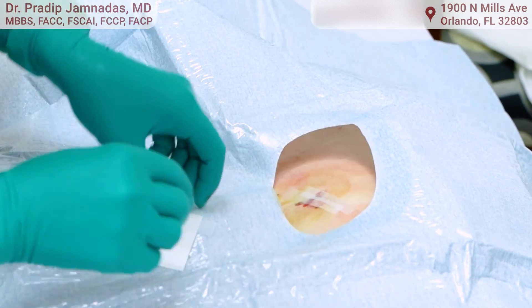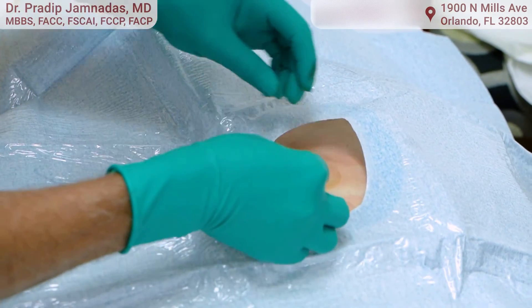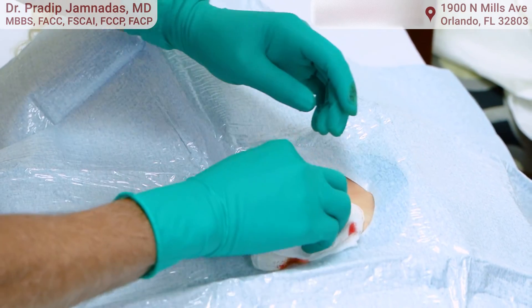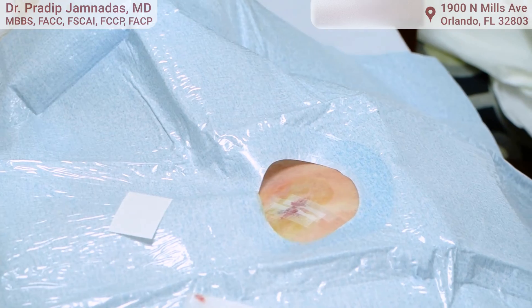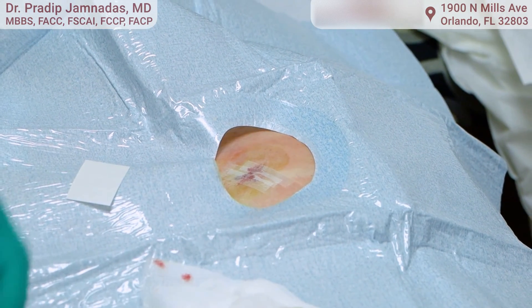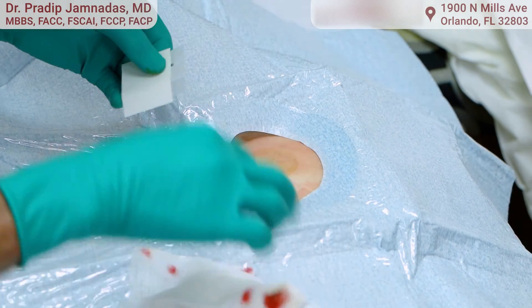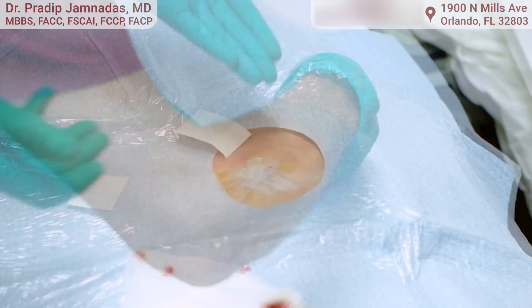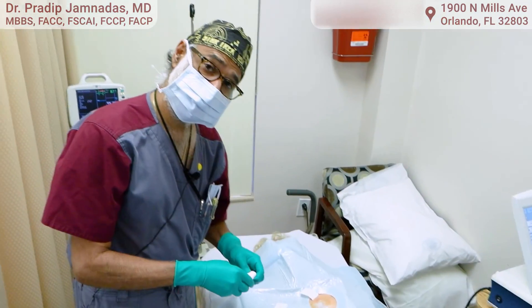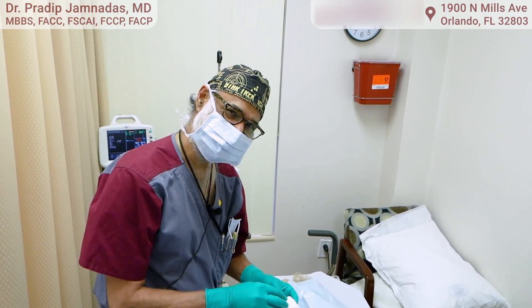These steri-strips fall off on their own so we don't have to remove them. The patient is asked not to shower for the next four days, just to allow the area to heal and keep it nice and dry. We give them instructions on how to do that. That's what the wound looks like. Thank you very much for watching this video — I hope you found it very useful.